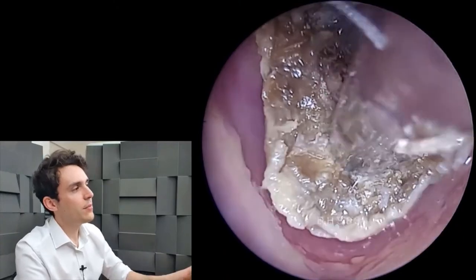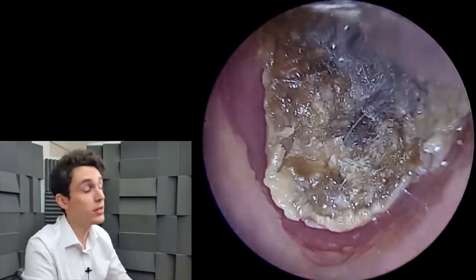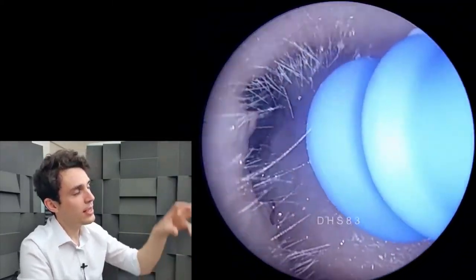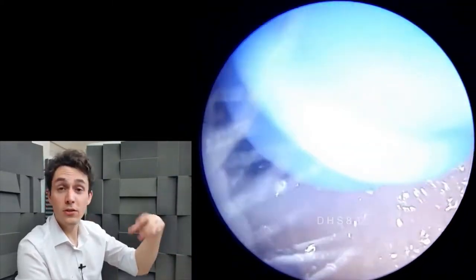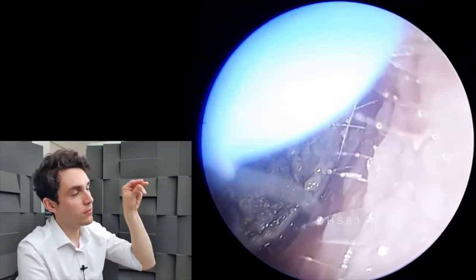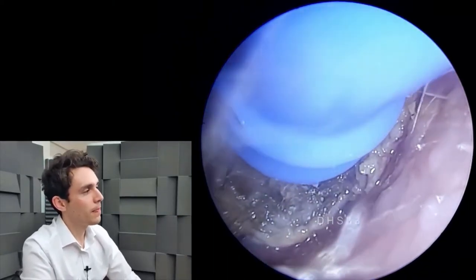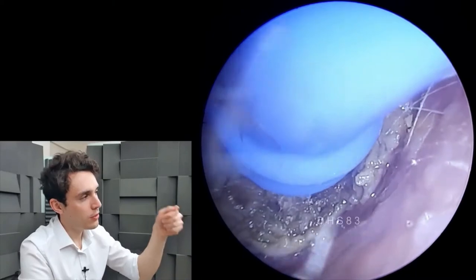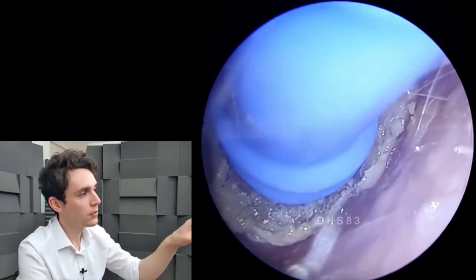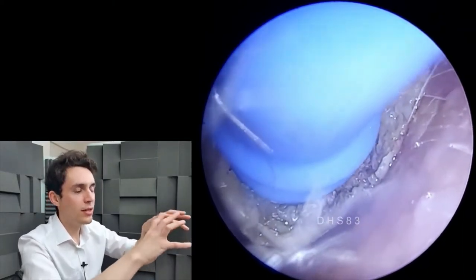The idea behind it is that it's primarily designed to remove foreign bodies from the nose and ear. You can see how the end of it is very soft silicone. The idea is that as you approach this foreign body — or in this case a plug of dead skin — when you activate it by closing the hole, the soft silicone tip will latch on to the surface.